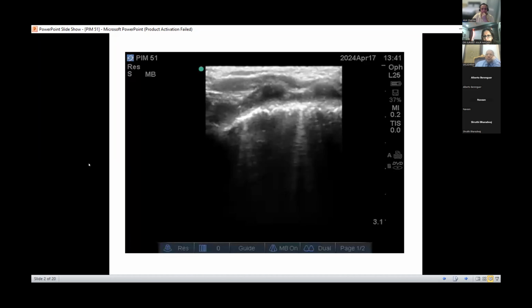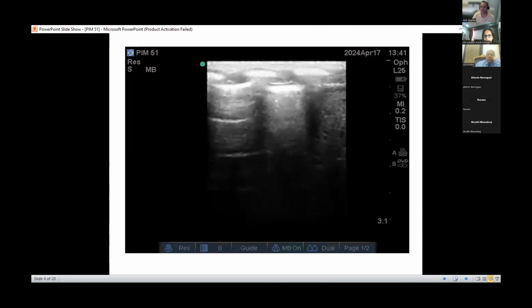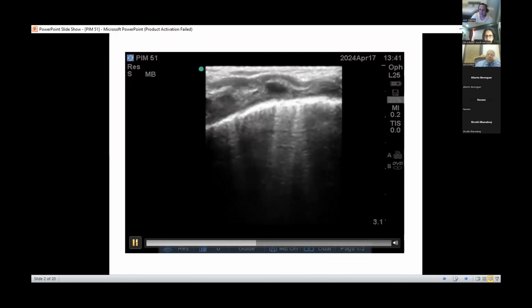So I put the probe on for the echo, and we found it was infracardiac TAPVC just yesterday. I then confirmed, and we referred the baby today. So I'm not sure if, with this lung ultrasound, I should have given surfactant. Let's see what everybody else thinks. It's a beautiful case, and I'm just curious to get others' opinions as well.